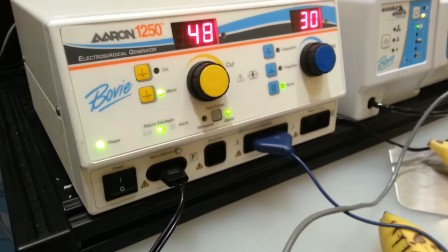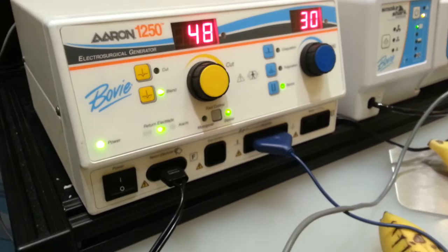Finally, the 1250 is an all-purpose generator, and it will allow me to basically do from nose jobs on pugs to declawing of cats, taking out large masses out of the animal. It's an all-purpose generator.